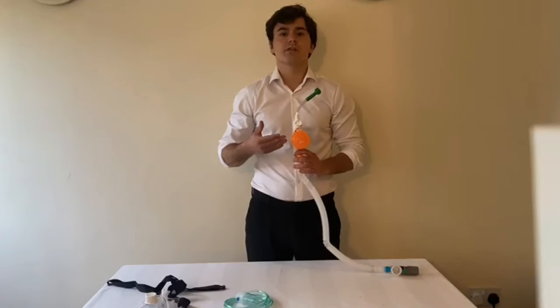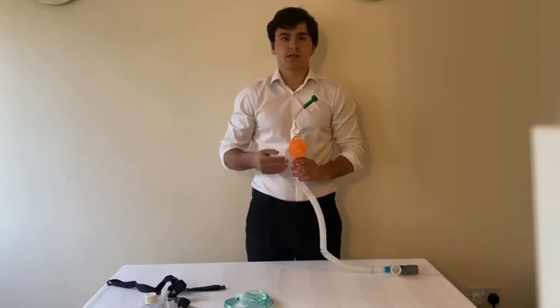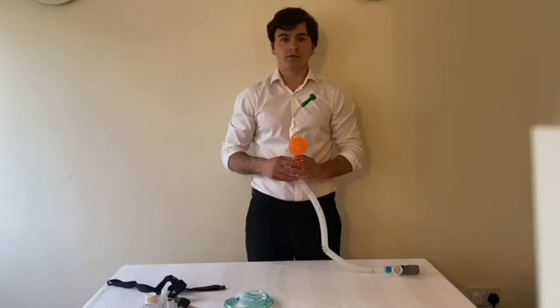Underneath the FiO2 dial you will find the 99.999% bacterial and viral filter. This is where the ambient air is drawn into the circuit to provide a total of 140 litres per minute of flow.